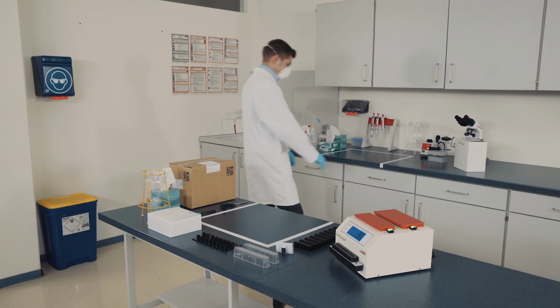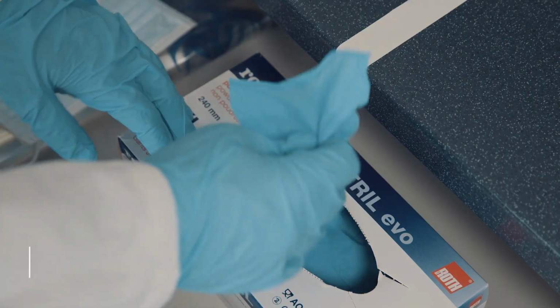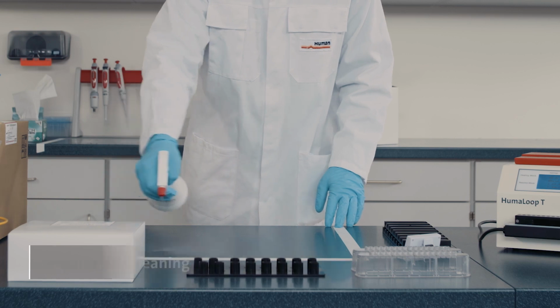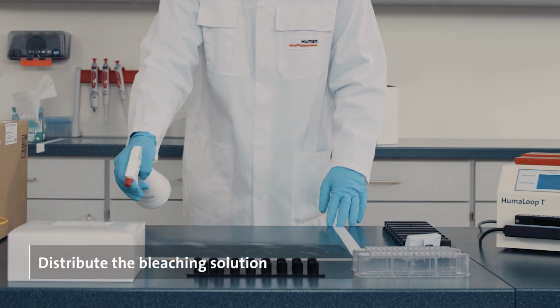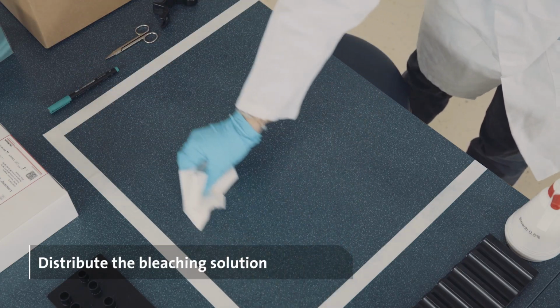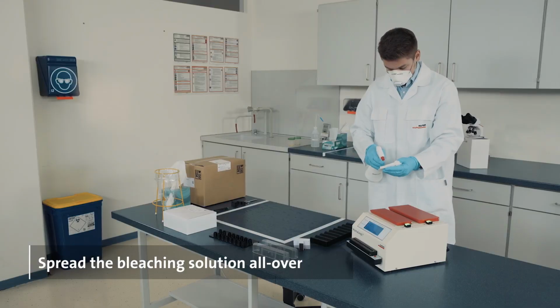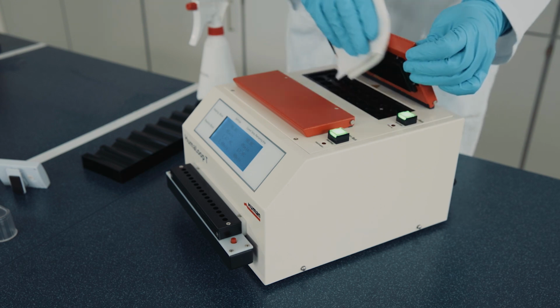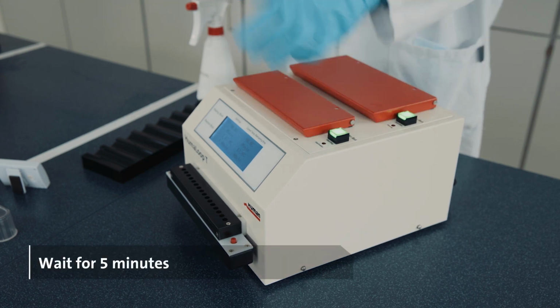First, put on 2 pairs of gloves, a laboratory coat, and a mask. For the preparation, clean the working areas thoroughly. Distribute the bleaching solution and spread it with a soft cloth all over. Also, clean the HumaLoop T. Let the bleaching solution incubate for 5 minutes.